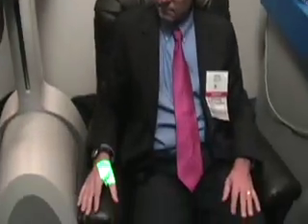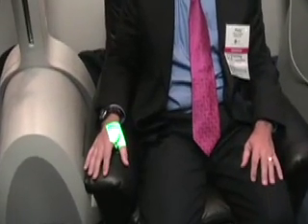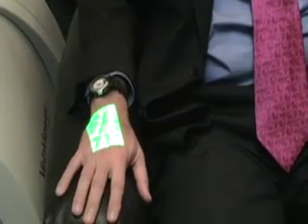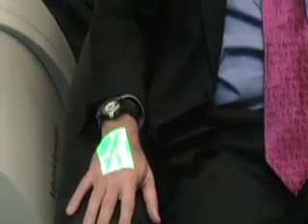It's a tool being used by leading-edge phlebologists. We've been selling it for months now, and it's used pretty extensively in sclerotherapy and ambulatory phlebectomy. There are veins that will be visible, your spider veins and telangiectasia, but there'll also be feeder veins, more reticular veins, that often are not visible to the naked eye, and if you don't get those in a treatment, you may have a recurrence very shortly thereafter.